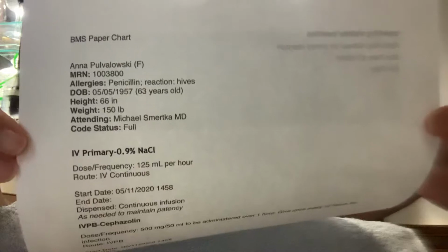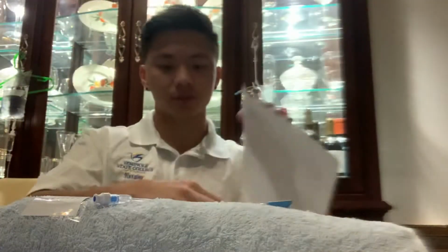I'm going to go ahead and start by showing you my medication chart that I have here completed. And I also have the BMS patient chart that I'm going to be referencing as well. So I have that. I'm going to go ahead and begin.